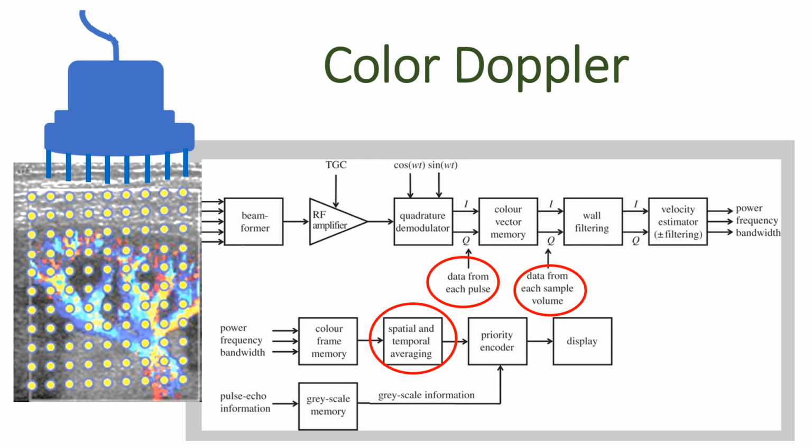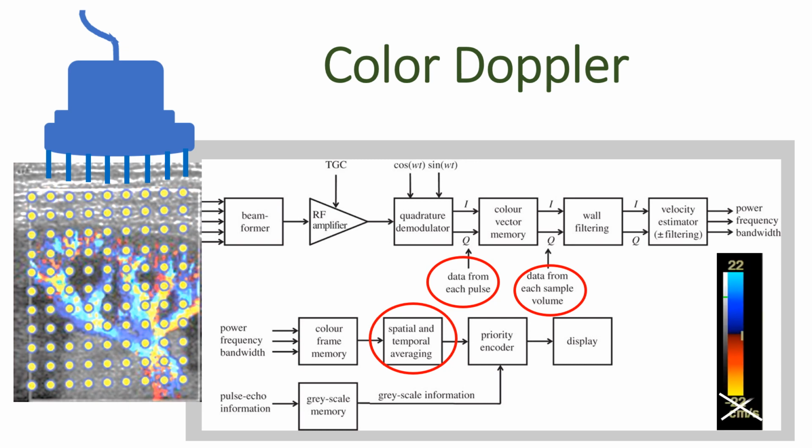The color represents the direction of the flow and the magnitude of the velocity, but the information is qualitative, not quantitative. The color bar should not be used to estimate the flow velocity. Even more, the scale is also not linear. The color map provides information on where velocities are higher or lower, but not on the magnitude of the difference.